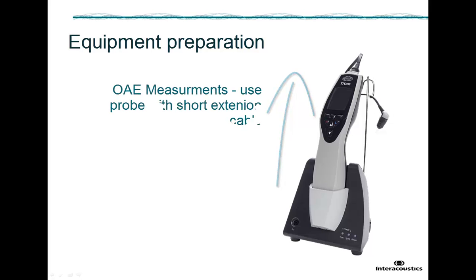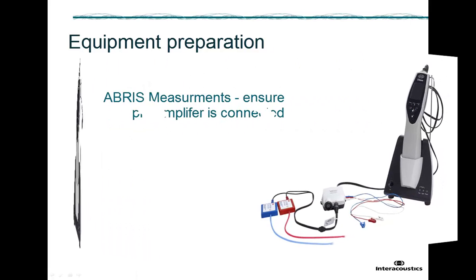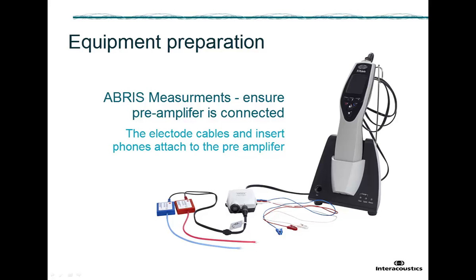For distortion product and transient-evoked otoacoustic emission measurements, it is recommended to use the probe with the short extension cable connected to the unit. For the ABRIS measurement, the preamplifier must be connected to the Titan unit. The electrode cables and transducers for right and left ear must then be attached to the preamplifier.